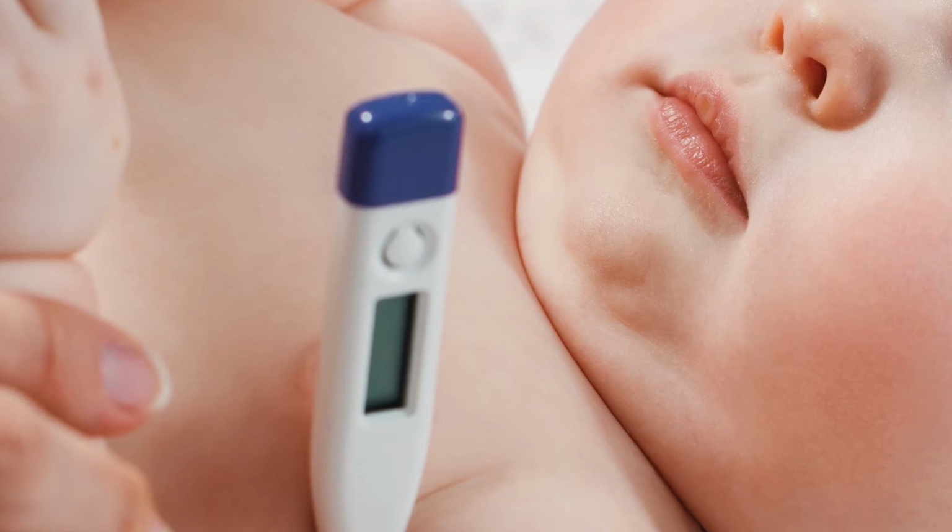The mother can hold the thermometer within the axilla by compressing the hand. But the disadvantage is that it will be around 0.5 degree further below the oral cavity temperature. That means it will be 1 degree centigrade lesser compared to the core temperature. In addition, if there is too much sweating or too much overclothing, this will affect the temperature measurement. Then the other 2 sites are relatively new concepts, that is on the forehead and in the ear.